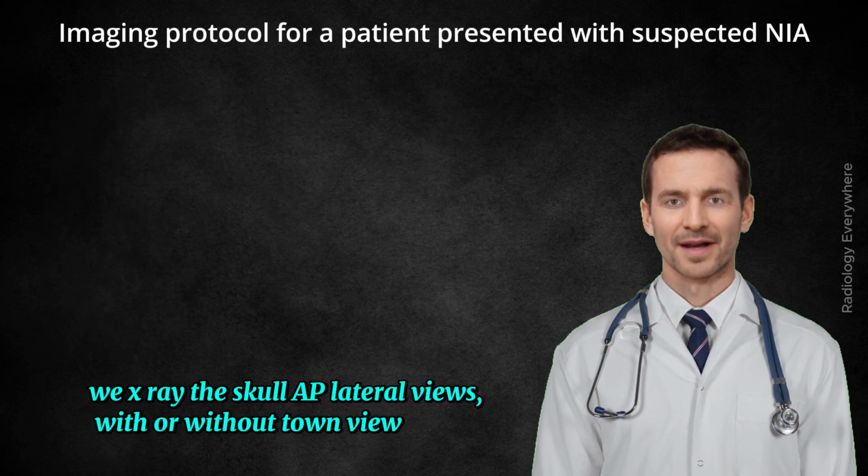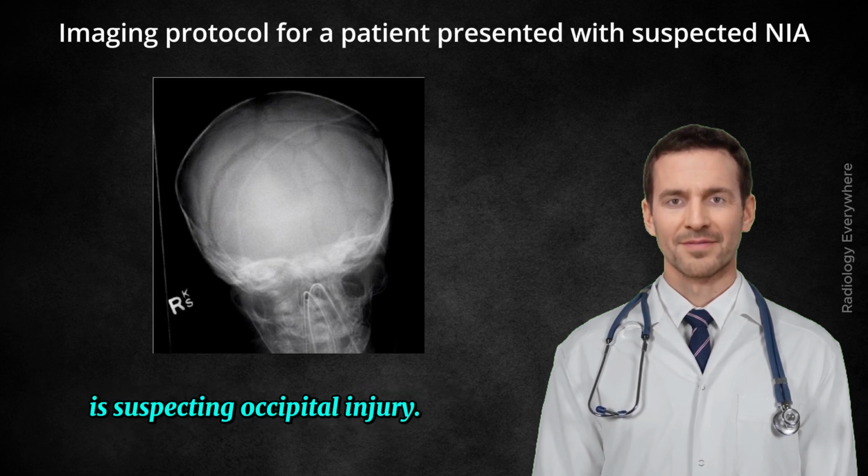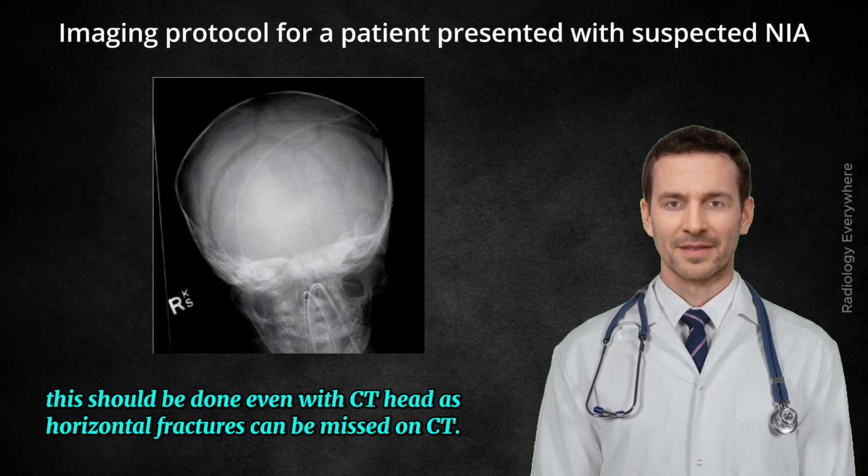We X-ray the skull: AP and lateral views, with or without Towne view if suspecting occipital injury. This should be done even with CT head, as horizontal fractures can be missed on CT.